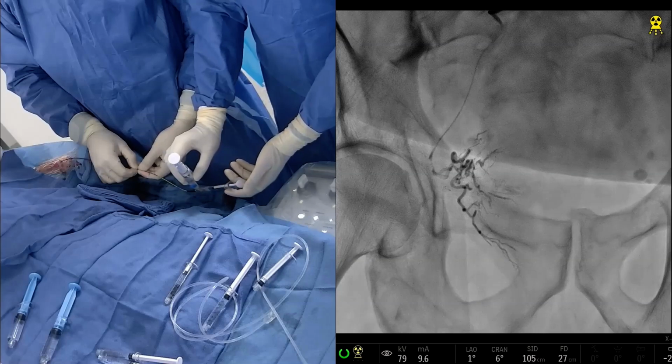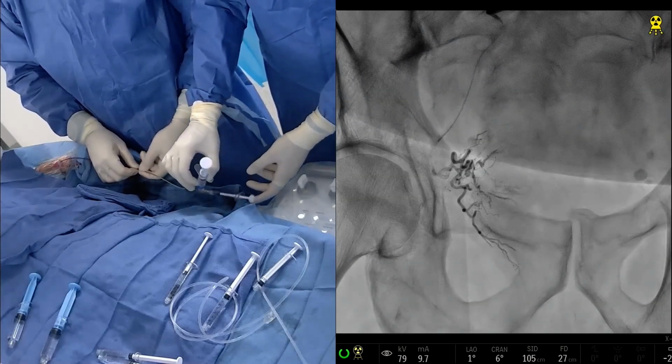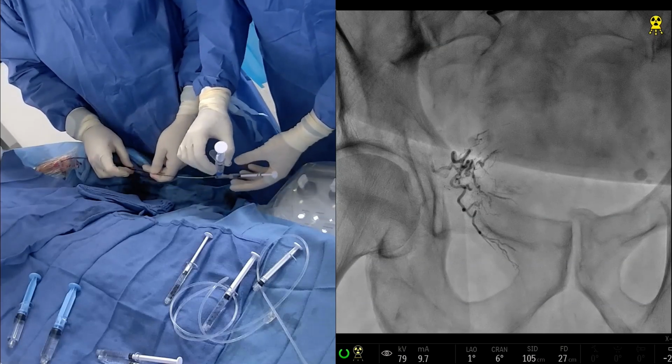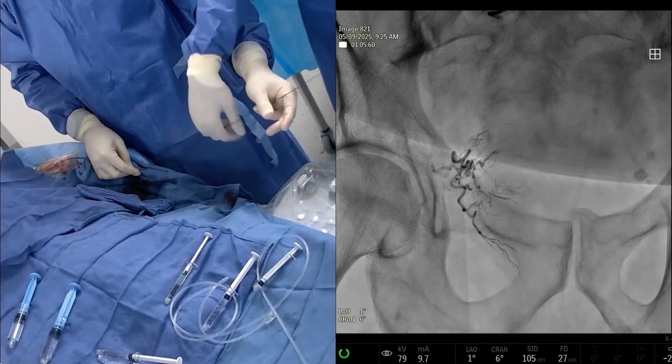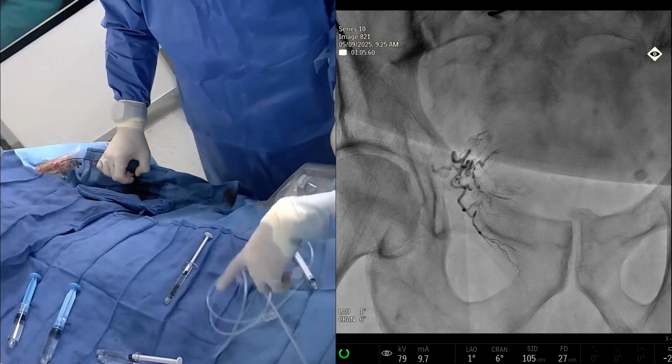And now we're going to remove this. And so I sort of shake the catheter a little bit. You can see there's a little bit of glue stuck on it here. And now it's off. And so now we can actually remove this all the way, and we're done with that side. So that's a pretty fast embolization, as you guys know, that this shortens our procedure time quite a bit.